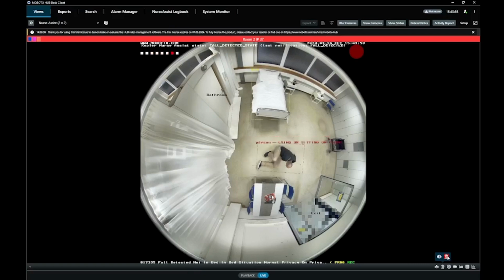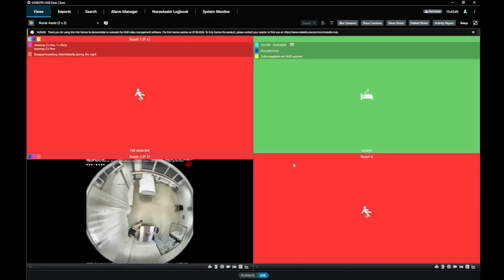Okay, I understood. You try to stand up by yourself. Carefully. Maybe take a short rest on the seat. Maybe you have another issue with a low blood sugar. I will come soon to you. Stay there. In 1 minute I will be there.